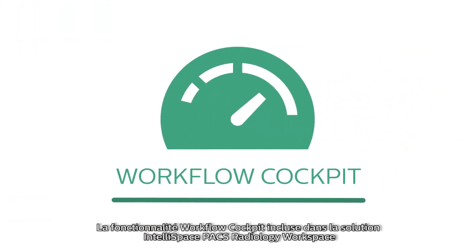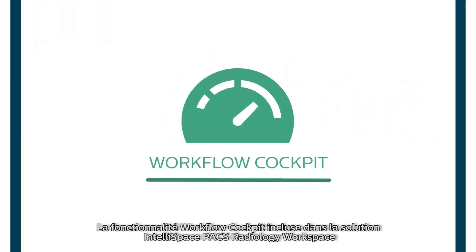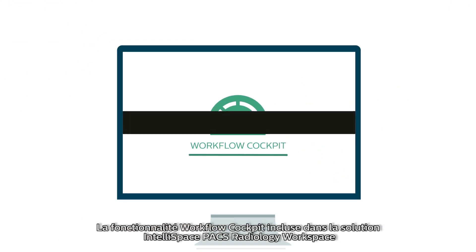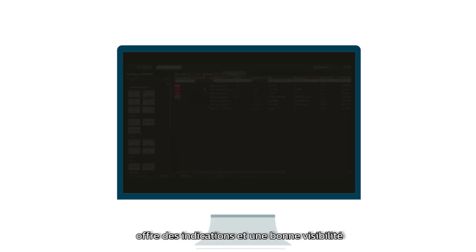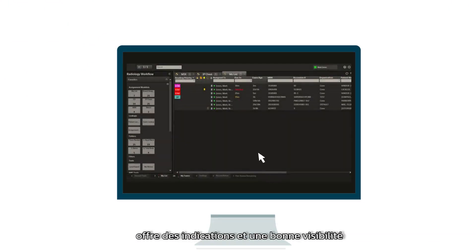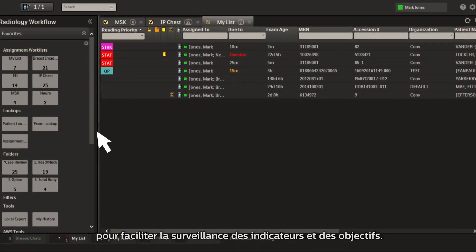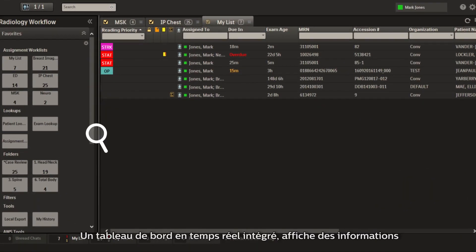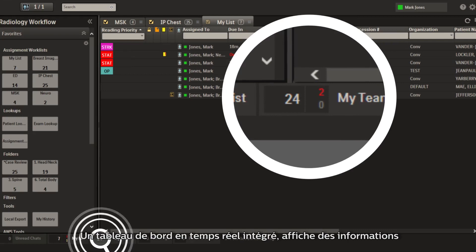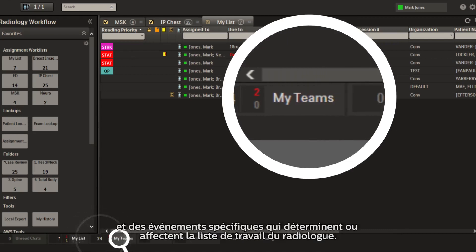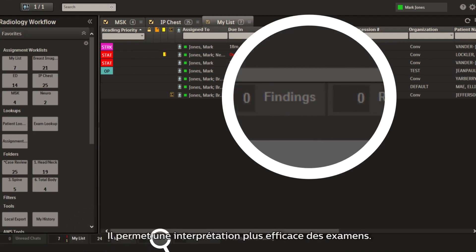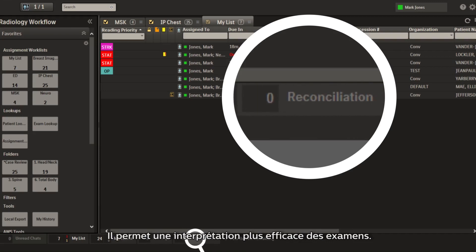The workflow cockpit included in IntelliSpace Pax Radiology Workspace Solution provides visibility and direction for easy goal and metric monitoring. It is an integrated, real-time dashboard that displays specific information and events that define or affect the radiologist work list, enabling greater efficiencies in interpretation of exams.